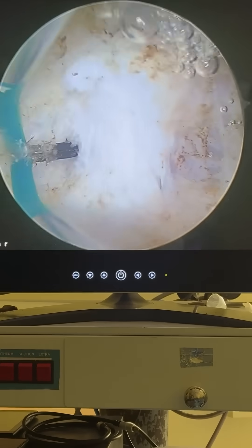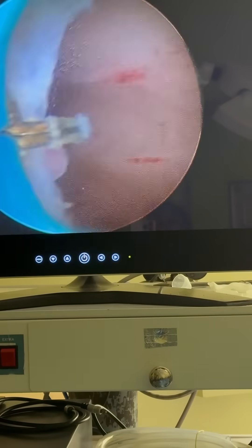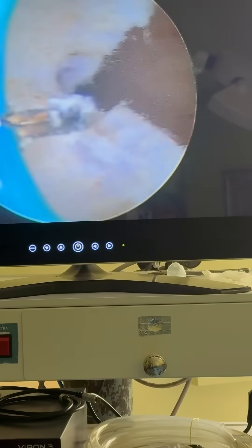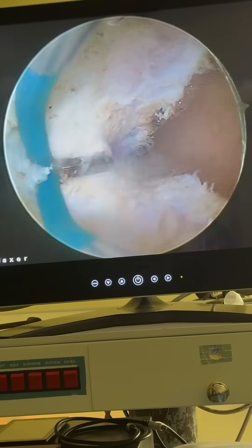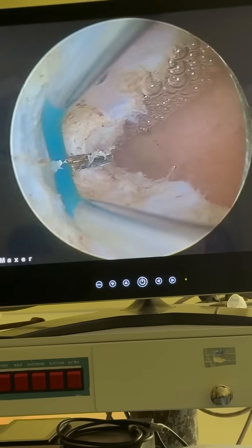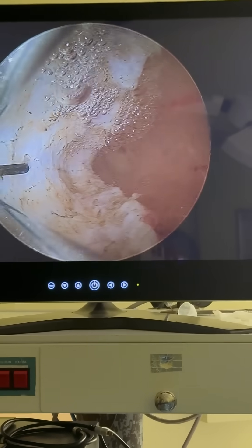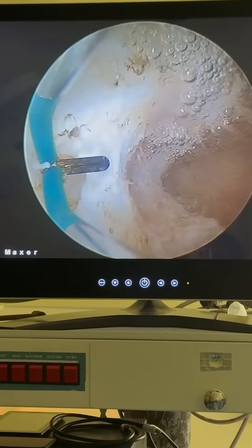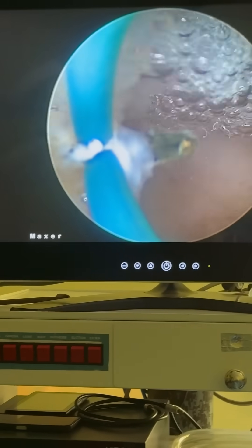This is an edited video at a speed of two times. You can see that I am taking very small bites slowly and cutting it. This is very important — when we are using the energy source, we have to use small bursts of energy and do it millimeter by millimeter, until we make sure that both ostia are seen in the panoramic view.